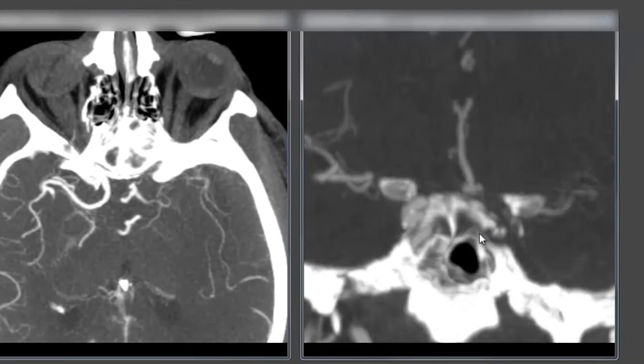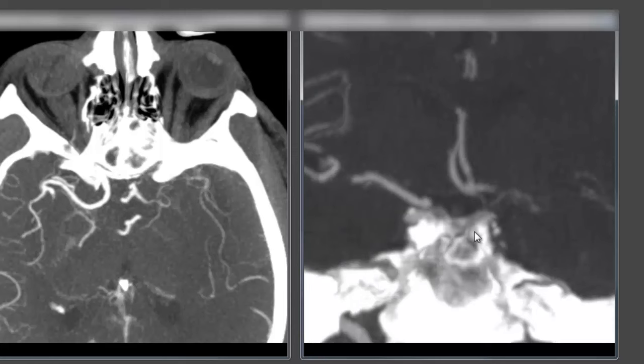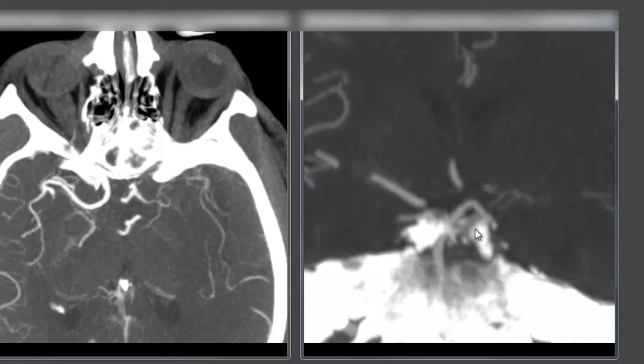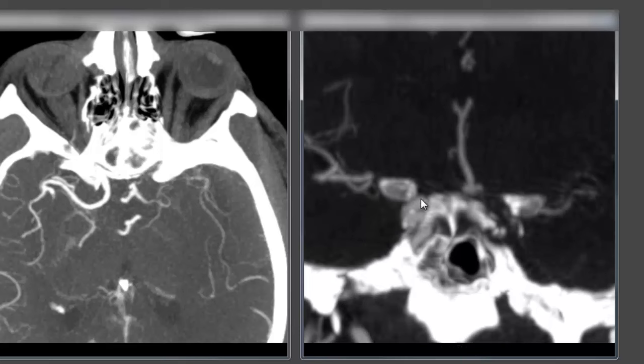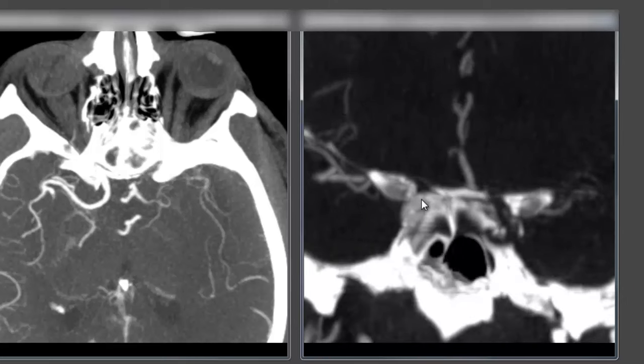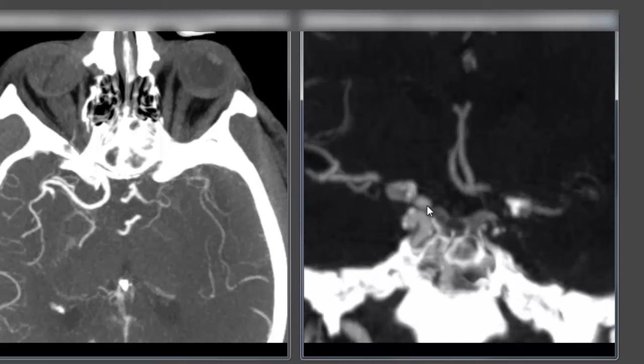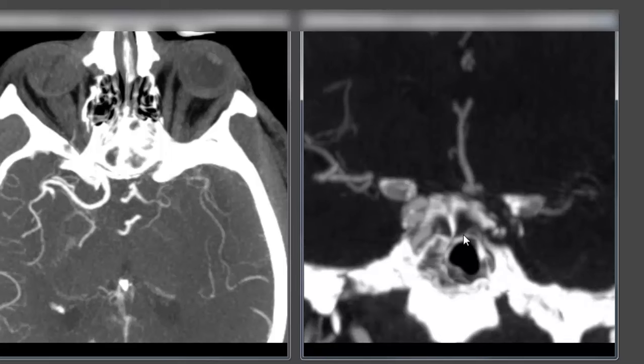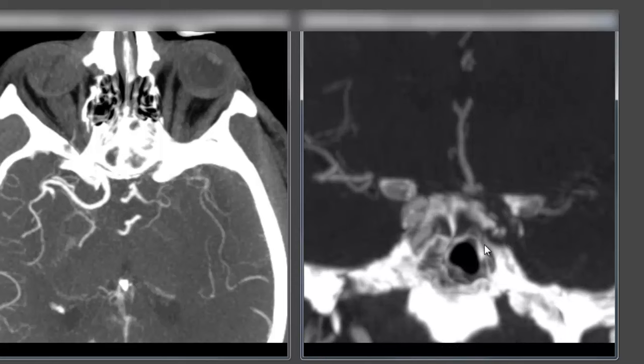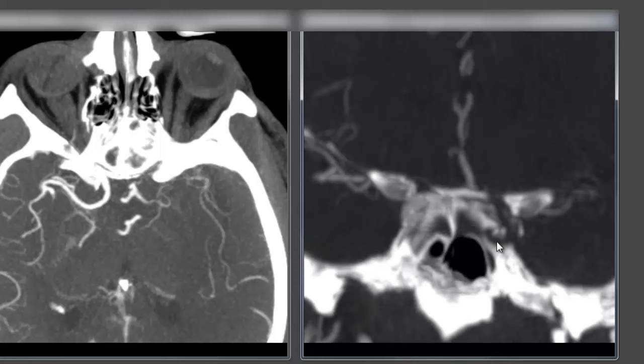Same picture on the coronal reconstructions. If we look down at the skull base we see the normal right internal carotid artery making its way through the skull base up to its terminus here and we do not see any contrast opacification, just an empty bony canal.